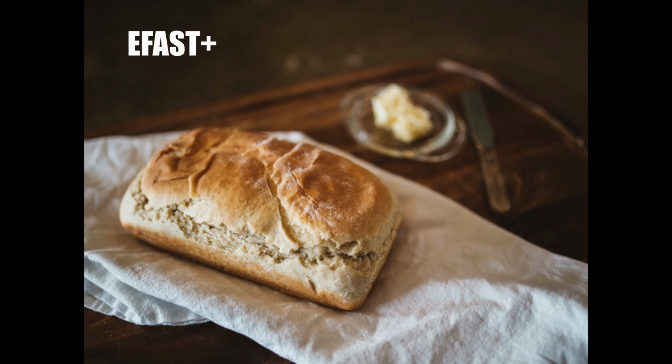We are back and going to talk now about the EFAST exam, EFAST Plus exam. This exam is incredibly useful both in low risk and high risk patients. It really captures a great deal of information about the patient and their clinical stability. This is really your bread and butter of emergency medicine ultrasound. If you can perfect this, you can make your life a lot easier.